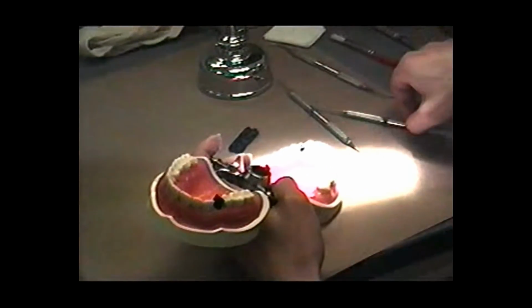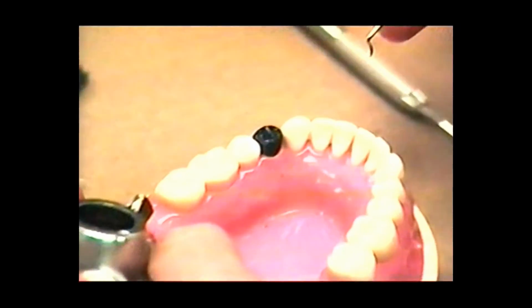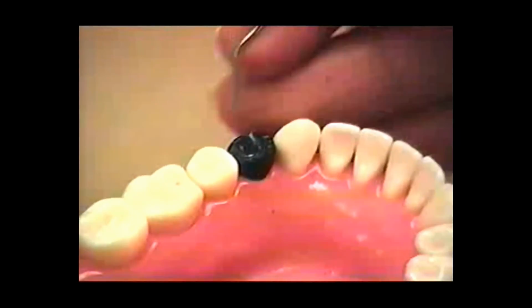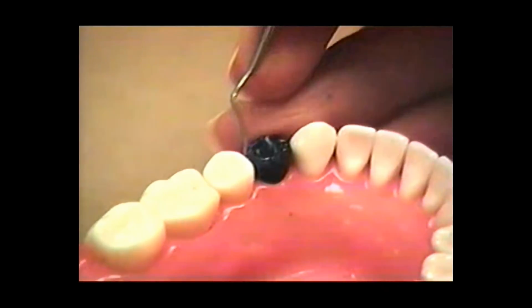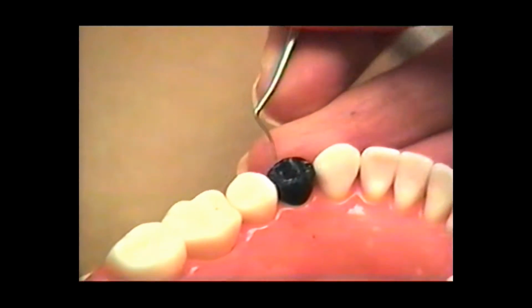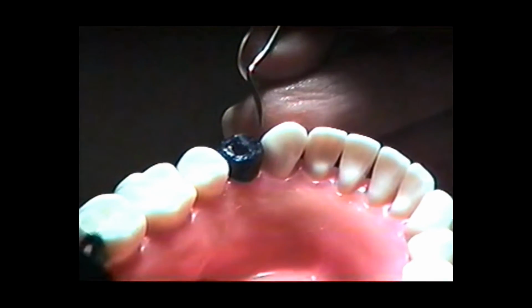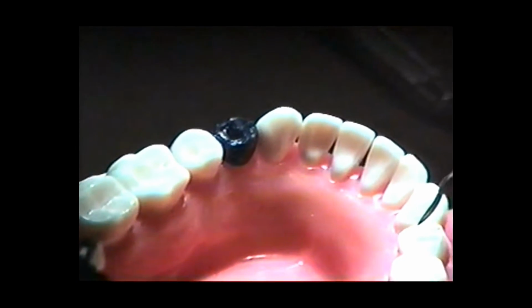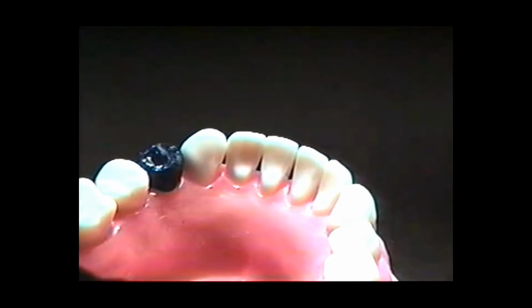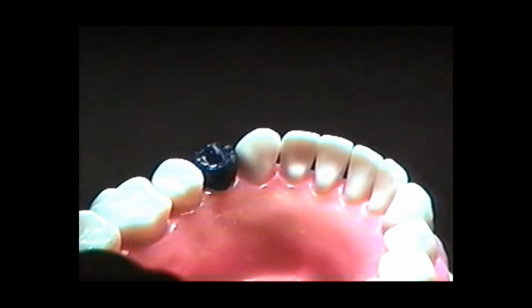Okay. I use the Hollenbeck carver or a Ward's carver to do this, taking it sideways at the thinner part of the carver and just coming around, or taking the tooth out and rounding that out, will allow you to get a good marginal ridge. I want to just stop for a second and make sure. I'm thinking maybe I need a little bit more wax here. And we'll carve the grooves in.